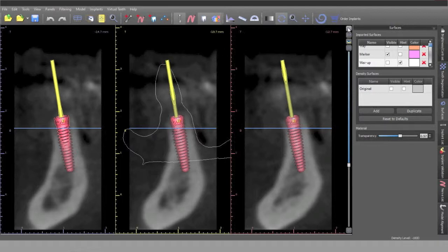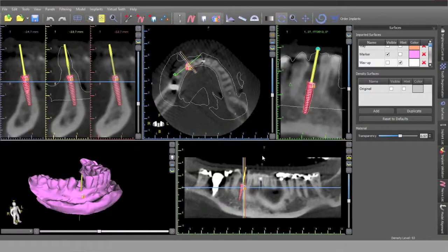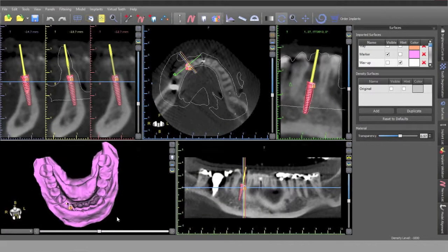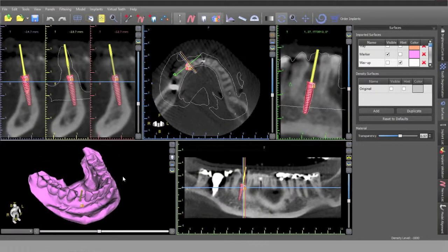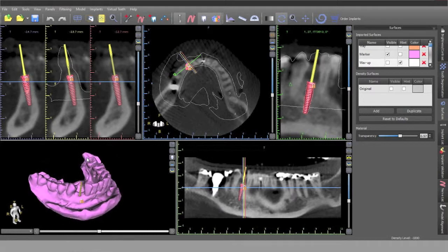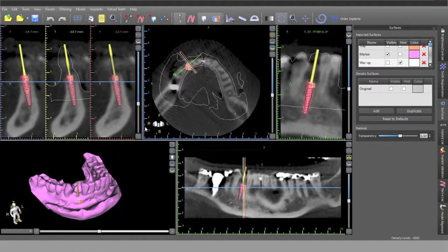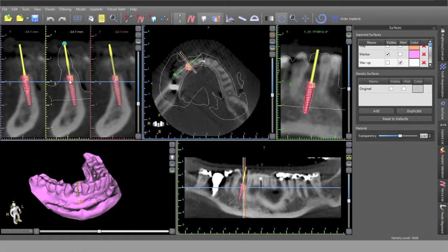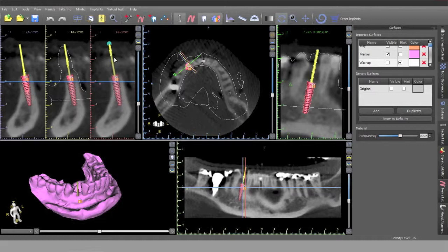If I didn't do the wax-up, I think the implant would have been in a little different position. And it may have been too lingual, too buccal. You still can swing this around a little bit, even though that's a 3.5 millimeter diameter tapered implant. And so there is room to swing it a little bit buccal-lingual. But if I see the wax-up tooth, that gives me the opportunity to put it right on the money.